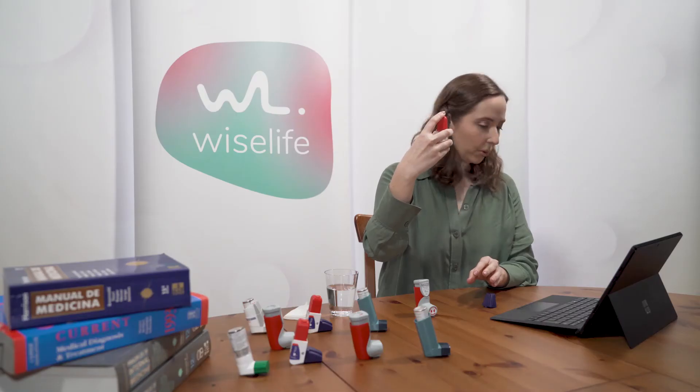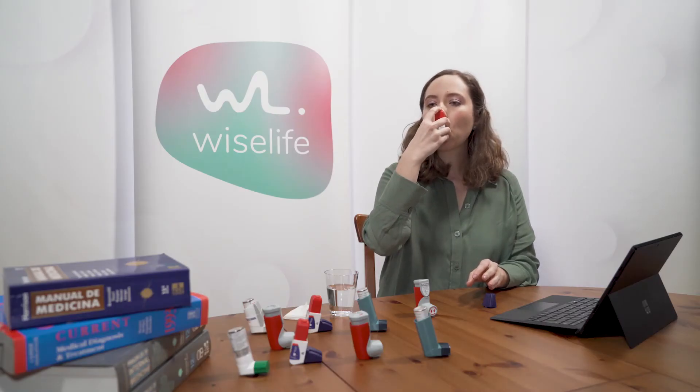Exhale until the lungs are empty. Place the device between the teeth, closing the lips and putting the tongue down. Inhale slowly and deeply, and activate the device during inspiration. Hold your breath for five to ten seconds.